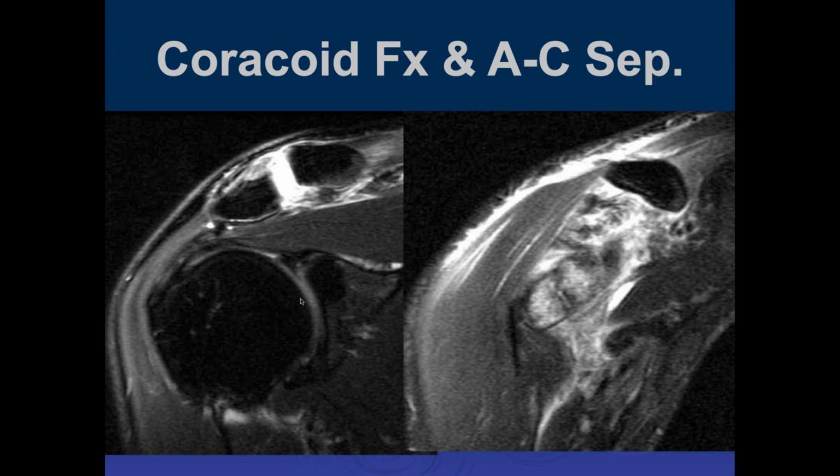John hasn't mentioned X-rays with weights on either hand, 5 pounds no more, and AP shots to see if there's displacement. It was thought that with weights on and displacement, that would mean that the CC ligaments were torn, and sometimes they would be partially torn.